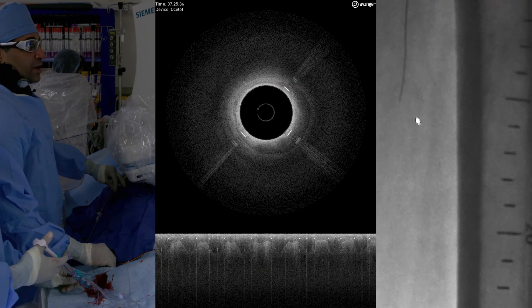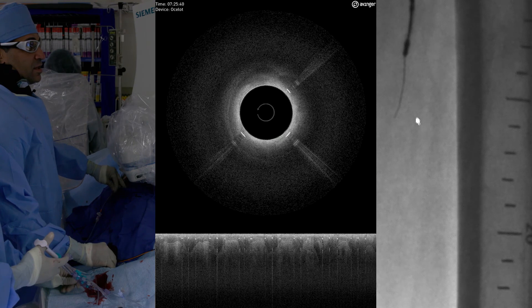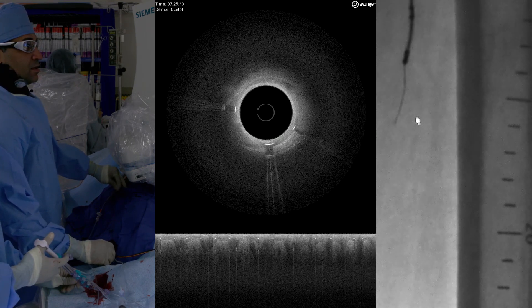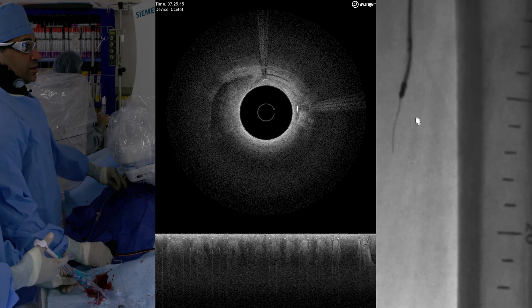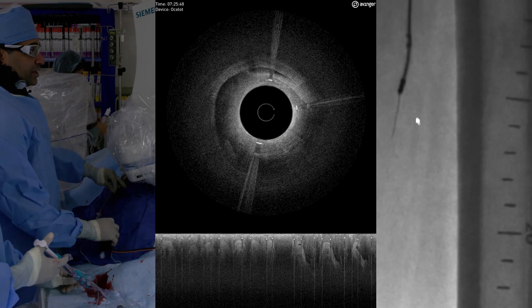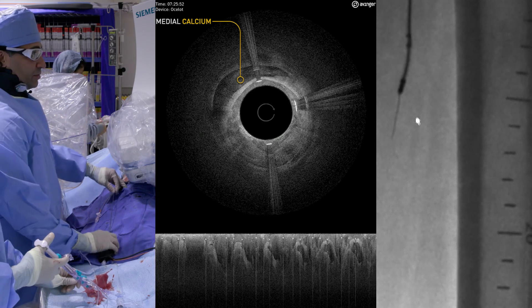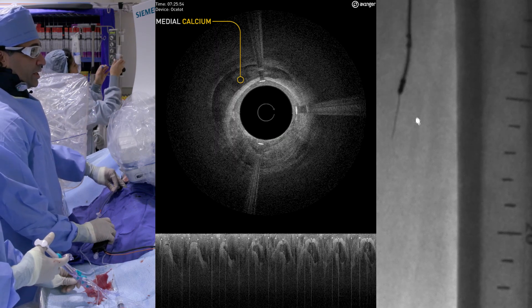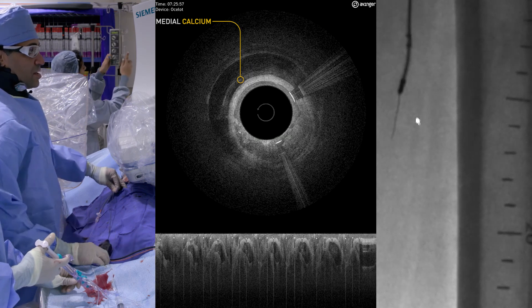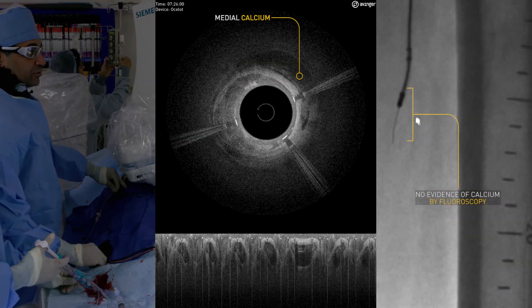So we're going to use that wire and we're going to slowly advance our Ocelot. We pop through. That looks like a good lesion there. We see right at 9 to 12, which you really don't appreciate on fluoroscopy.